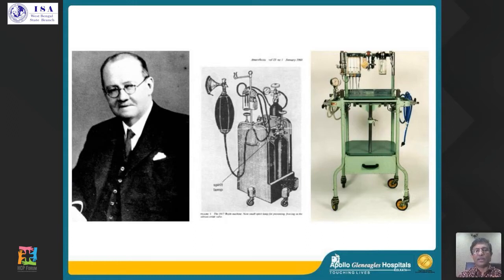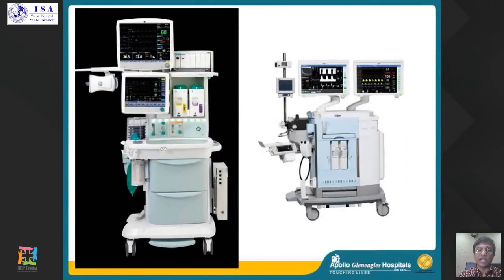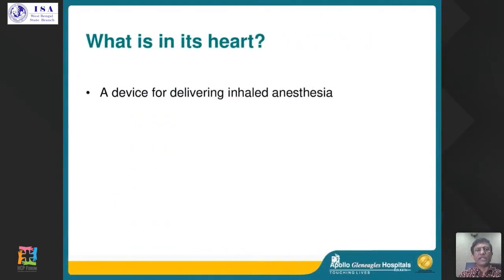And that was the initiation of the anesthetic machine, to today's day and age, when we call it the workstation. And you have so many, all very sophisticated, all very high-end, making it very, very safe as to the delivery of the anesthesia.